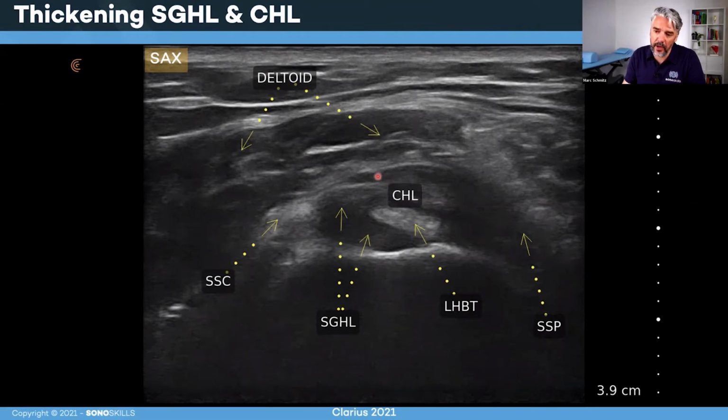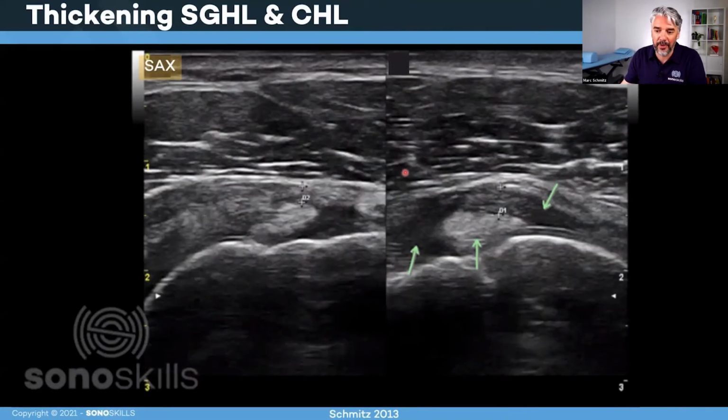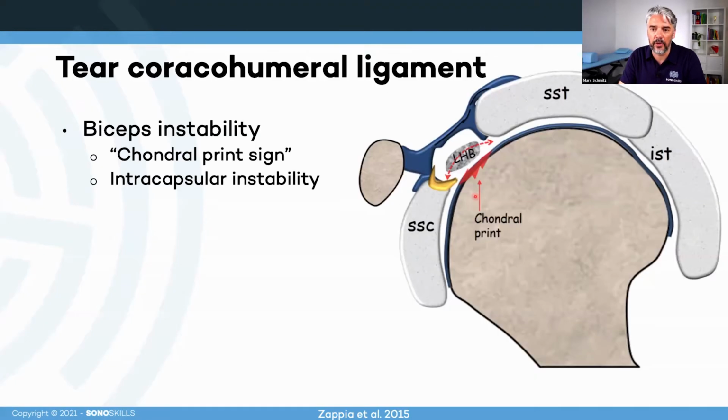Another thing we can see here is an effusion in the subacromial subdeltoid bursa. In the video, we saw only a hyperechoic thin line, but here we can see this effusion. So, thickening of the ligaments and also swelling of the bursa. This image also shows the same thing, but I implemented it to show you the increase of the coracohumeral ligament, which wasn't that clear in the other image. Sometimes the coracohumeral ligament can thicken quite a lot, and this is definitely also a sign in capsulitis or frozen shoulders.